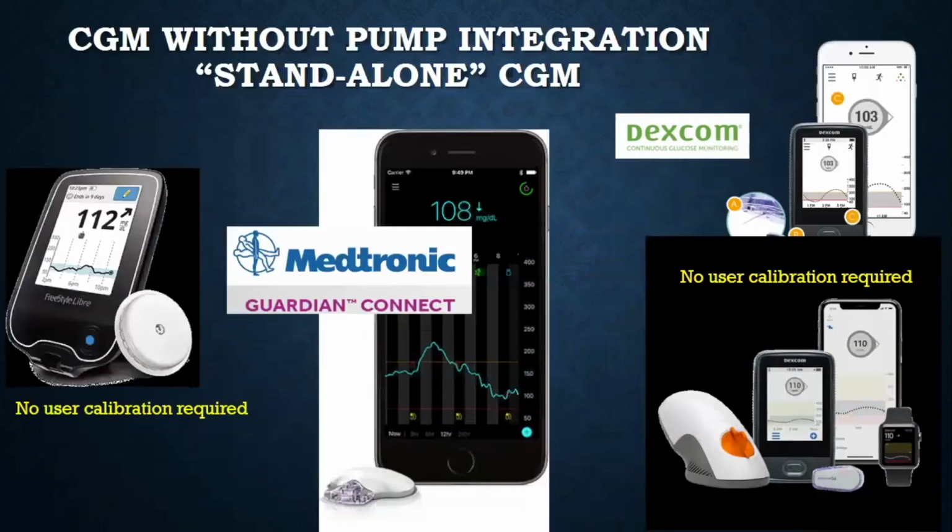There are continuous glucose monitoring systems that don't communicate with pumps, which we'll talk about later, but they're called standalone CGMs. This is really just for a patient to wear a continuous glucose monitor and understand what's going on with their glucose all day. When they wear it, they have a little sensor that's attached all the time, and they get glucose readings about every 5 minutes. This is something called the Freestyle Libre, which is a flash meter.